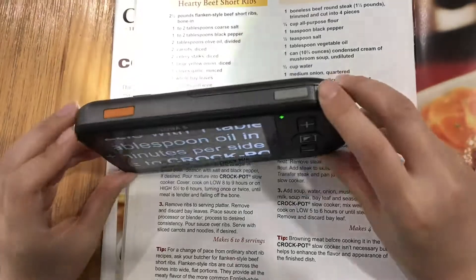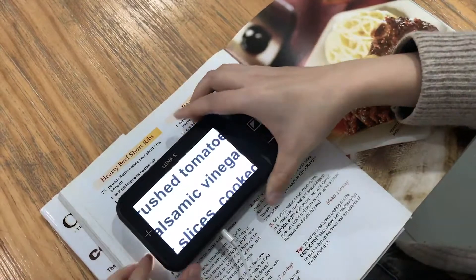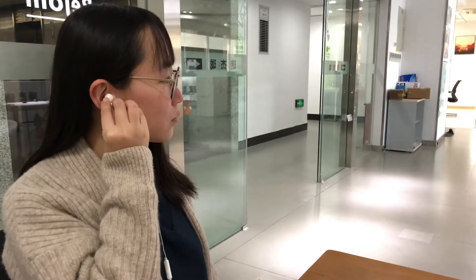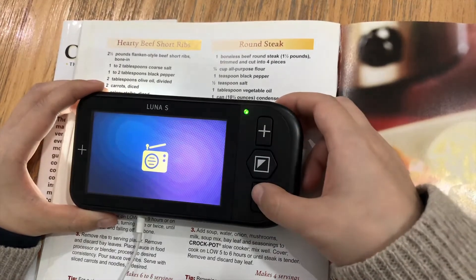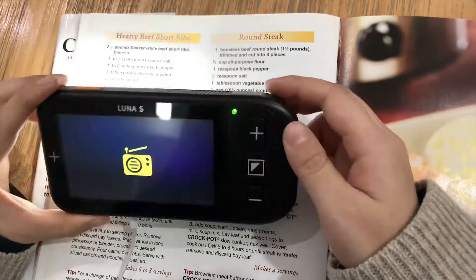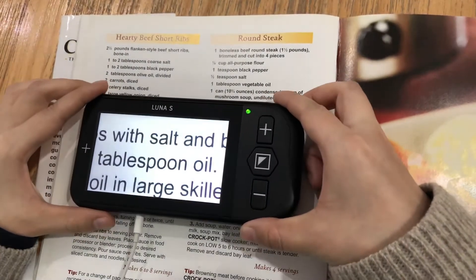Unfreeze the image by pressing the freeze button again. Advanced Functions: Use the earbuds to enjoy your favorite radio programs. Press the freeze button and the mode button simultaneously to activate the FM radio. Put the earbuds in. Press the zoom in or zoom out buttons to change the radio channels. Press the freeze button to increase volume or the mode button to decrease it. Press the freeze button and the mode button simultaneously again to exit.